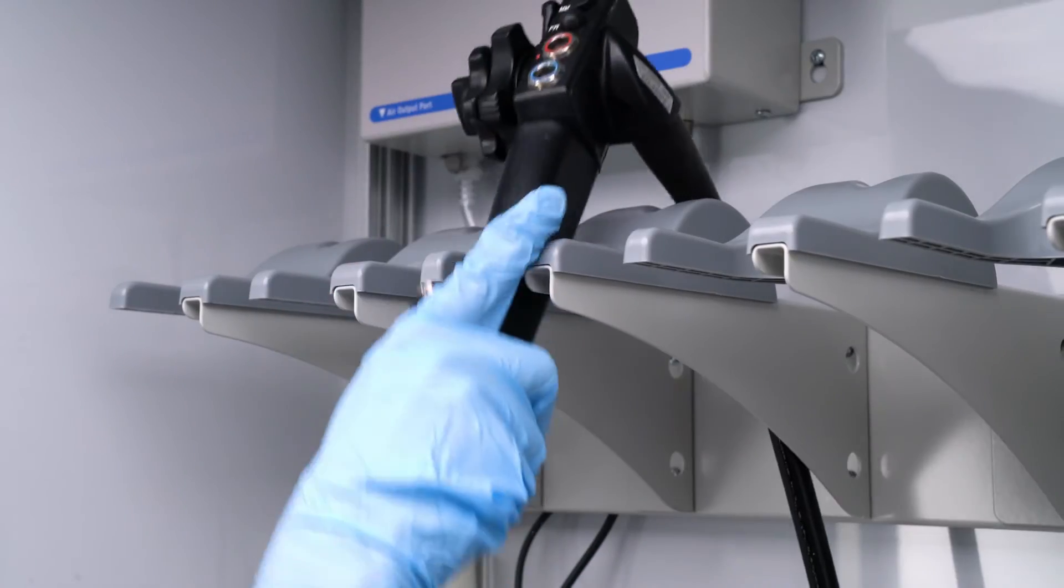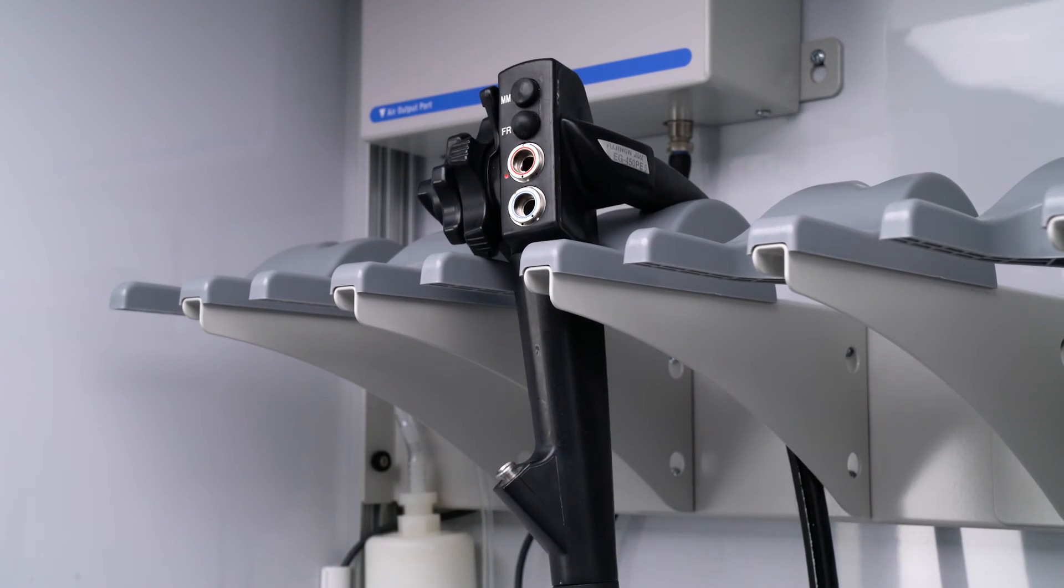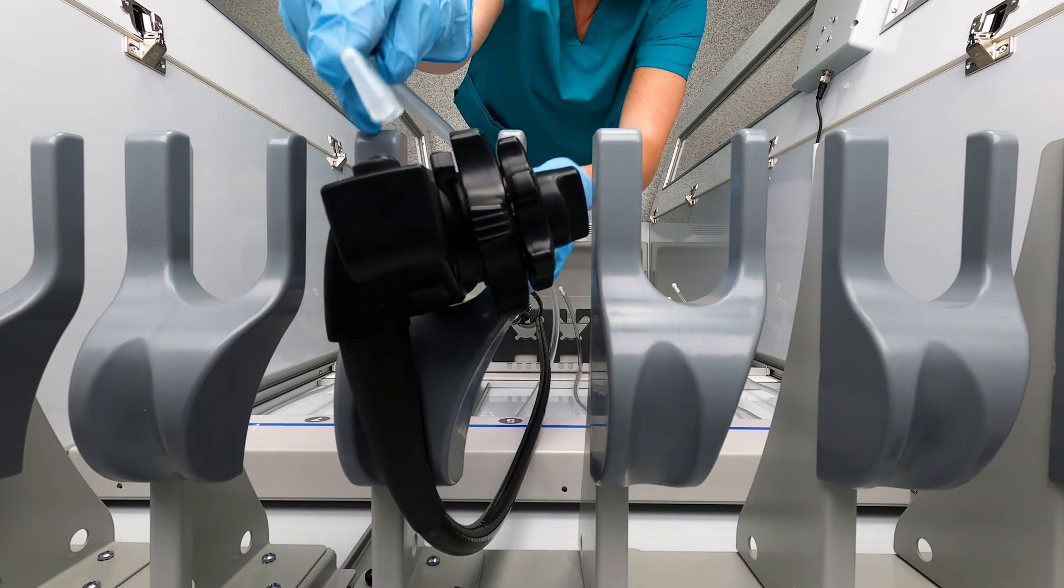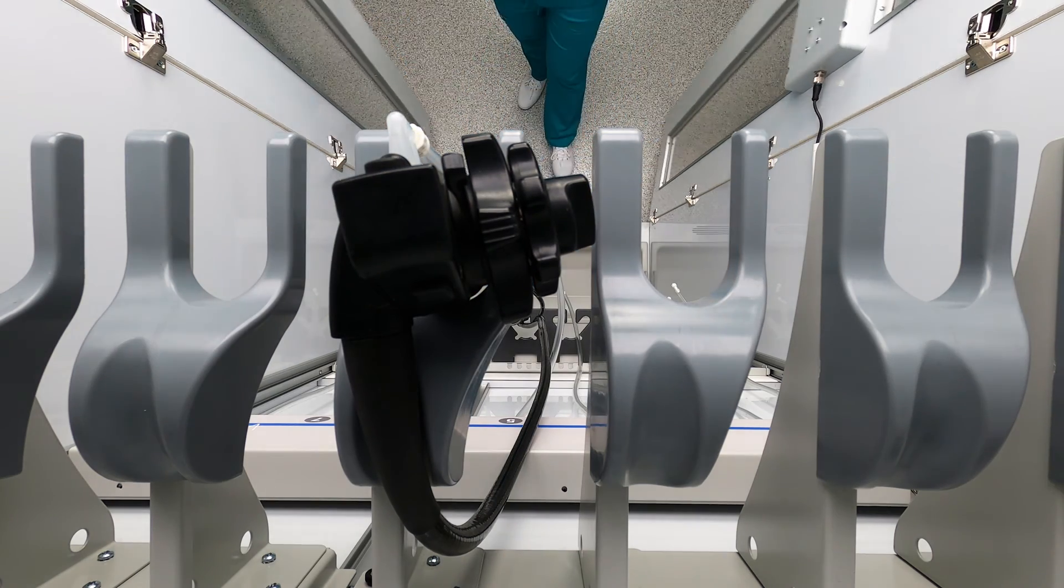The cord and tube management system keeps endoscopes organized, secure, vertically stored, and elevated away from the drip tray and other surfaces.